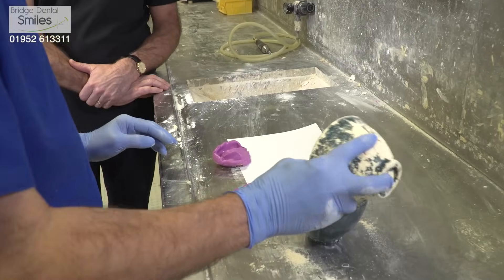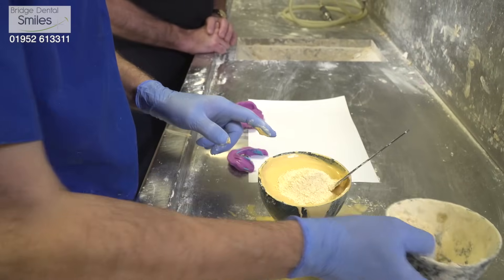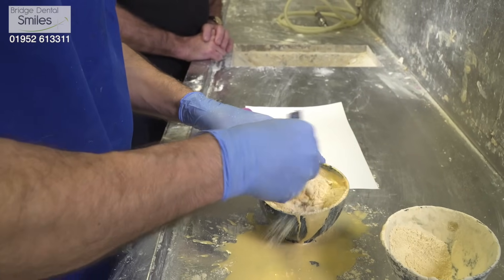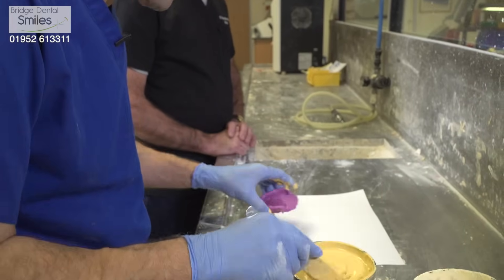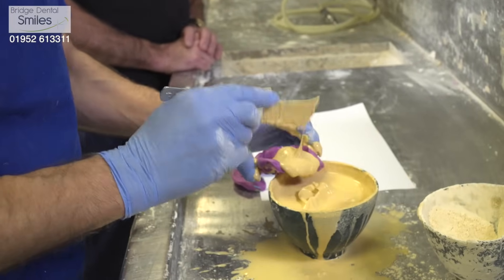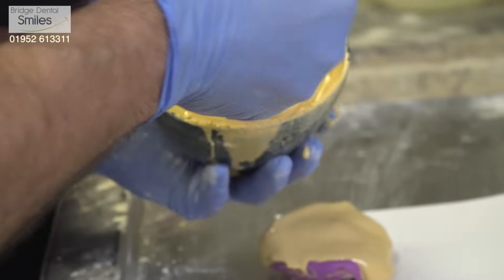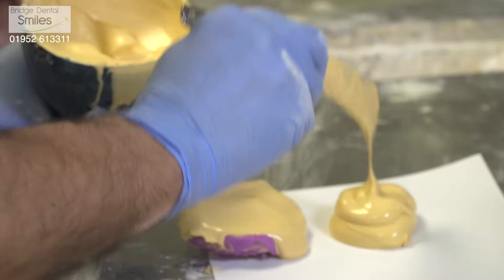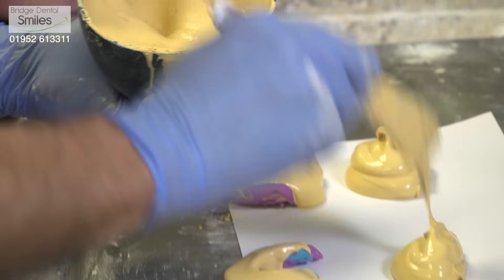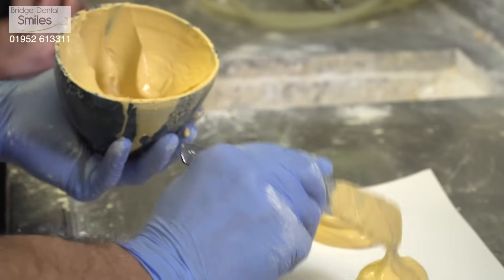So here's where we start off. This is all done by hand — it doesn't have to be exact at this stage, these are first impressions. Then we just gently tap the plaster in. This whole process is important because if you don't get this right there's no accuracy. If you put holes all over it or miscast them, then it's back to square one, which means another impression for the patient.